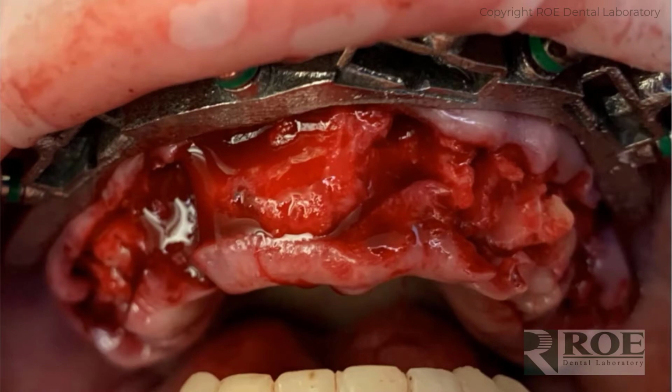And this is a little bit of a twist on this case, where it's just not that common, and I think it's a good idea to leave the labial flap. The contraindication for this is that the patient will now have 4 holes in the labial tissue, and often those have a suture in them, and it'll cause a little bit of discomfort.